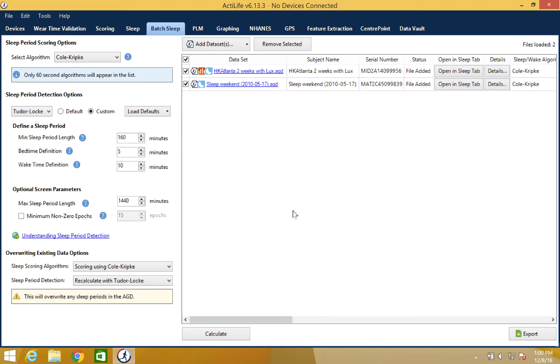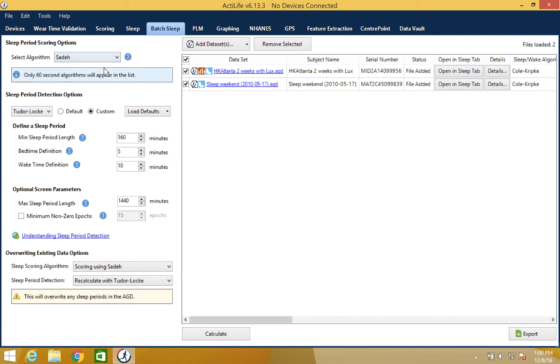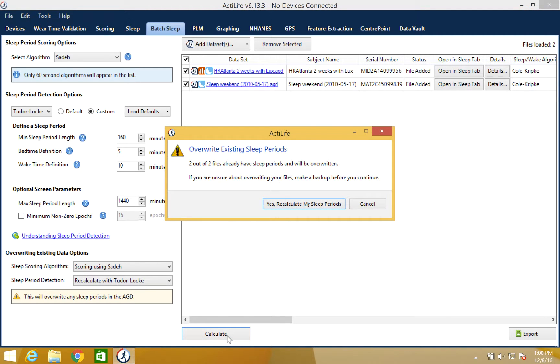Once you've added all your data sets, you can then select your sleep scoring algorithm and your sleep period detection options. Once these are all selected, click Calculate and your files will be processed and scored.